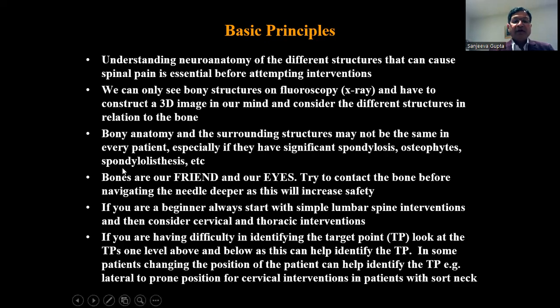Bones are our friend and our eyes. This is a very important statement, because on fluoroscopy, you can only see bones. And as I said earlier, you have to construct a 3D image and imagine the structures around it. When you start the procedure, it's always important to try to contact the bone before navigating the needle deeper, as this, in my opinion, will increase safety.